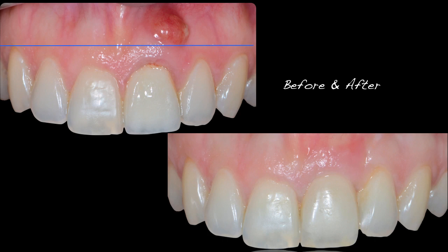This is a small comparison. If you draw a line in between the canines and the lateral incisor, you can see originally there was a little step in between the left central incisor that was treated and the right central incisor. And if you recreate that same line on the final photograph, that step is conserved. So the contours of the crown came back to its original position.